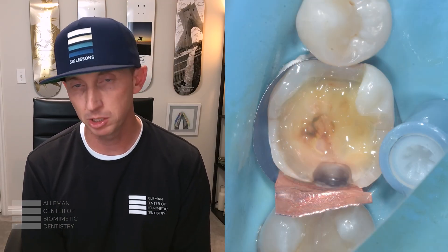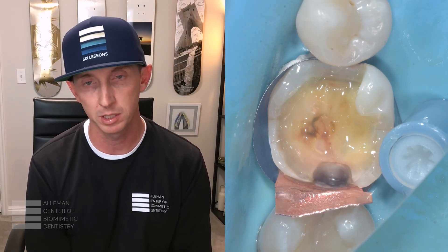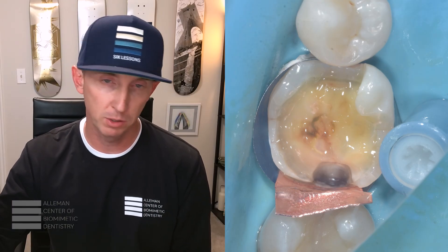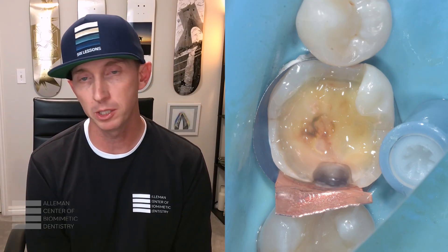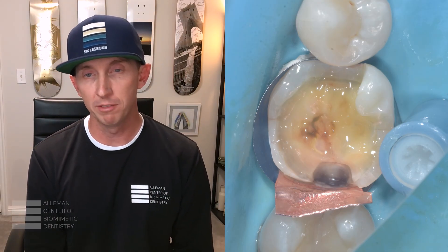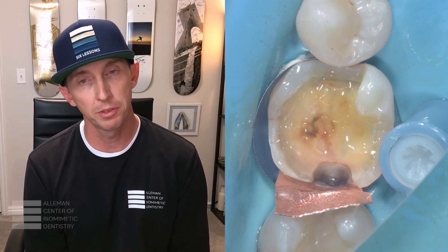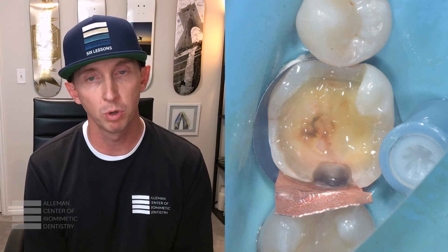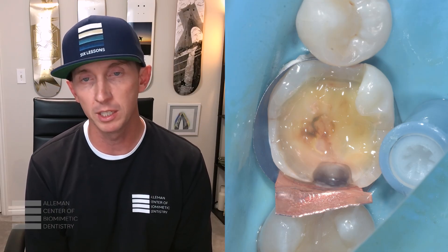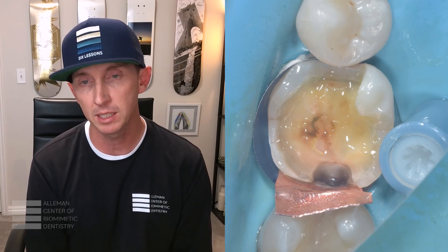We've all been frustrated using a traditional Tofflemire or an auto-matrix or a sectional matrix, where as we've placed it in this deep box, as soon as we put any apical pressure, the band crumbles. I can very distinctly remember my first frustration with a case like this — about three years out of dental school. I was restoring a tooth that was endodontically treated, and no matter how many bands I used, I could not get the band seated deep enough.